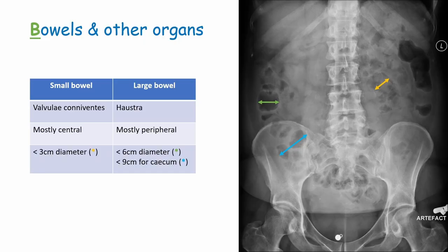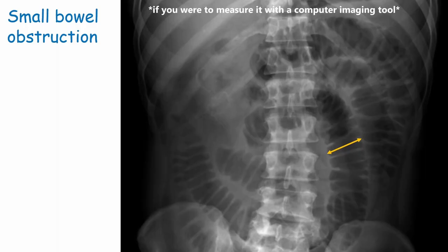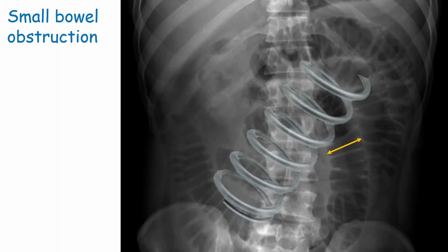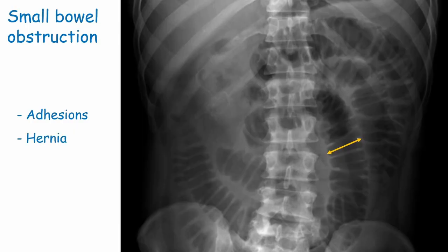We should always apply the 3-6-9 rule by checking the widest part of each bowel section to rule out obstruction. An x-ray showing small bowel obstruction will show central bowel with valvulae conniventes and a lumen over 3cm wide - sometimes referred to as a coiled spring appearance. Small bowel obstruction is most commonly caused by adhesions, where fibrous scar tissue connects tissues and organs after surgery. Other causes include hernias and cancer.